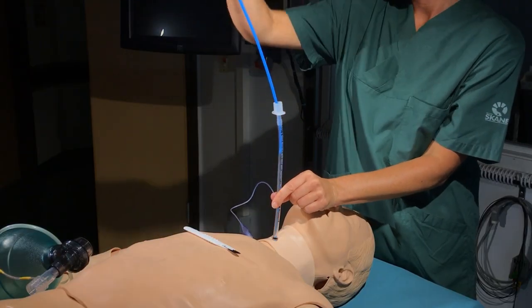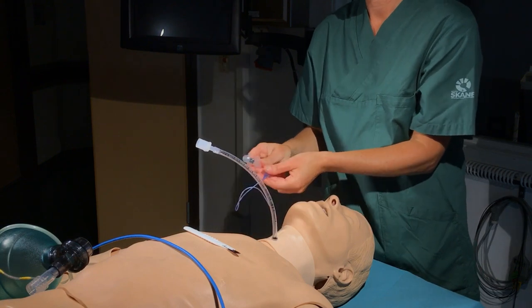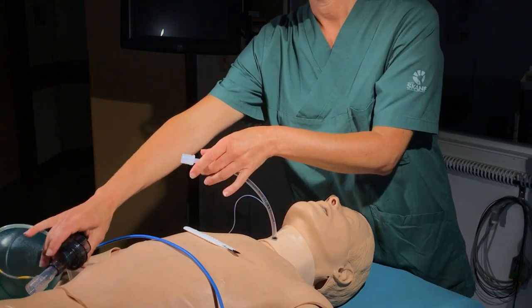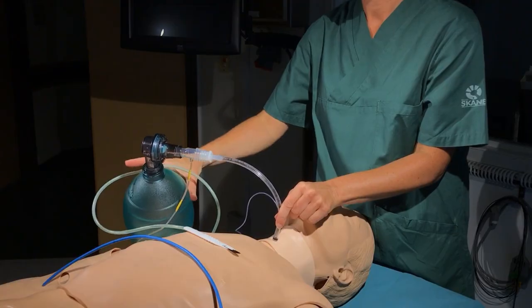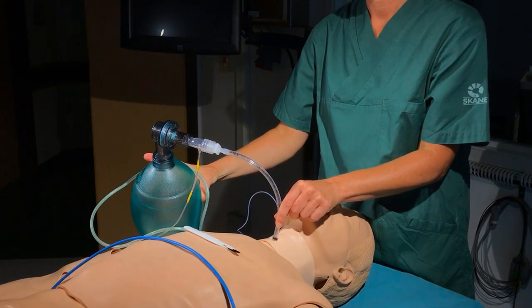The bougie is removed and the cuff is inflated. The position is confirmed using capnography and the rising of the chest wall during ventilation, taking special care not to lose the position of the endotracheal tube. A patent airway has now been achieved.